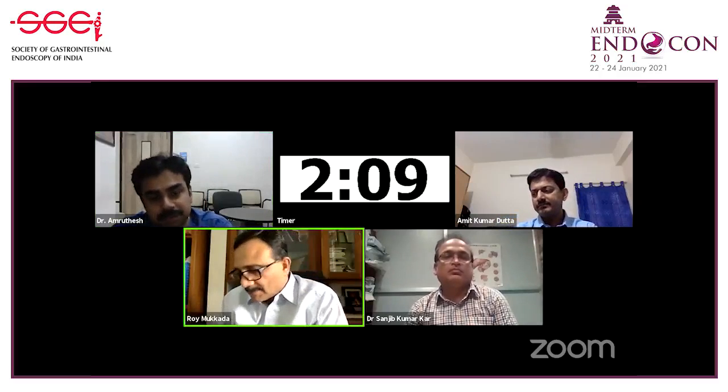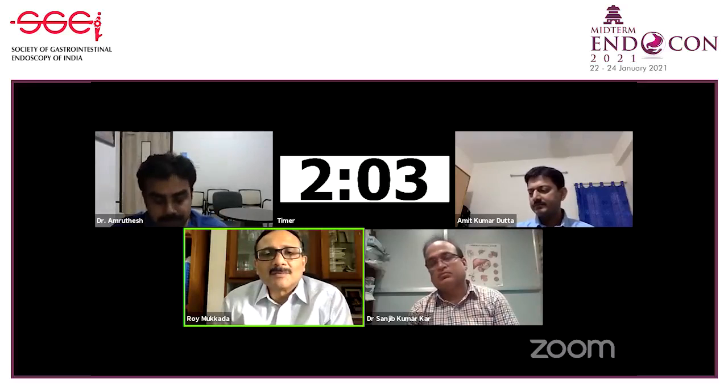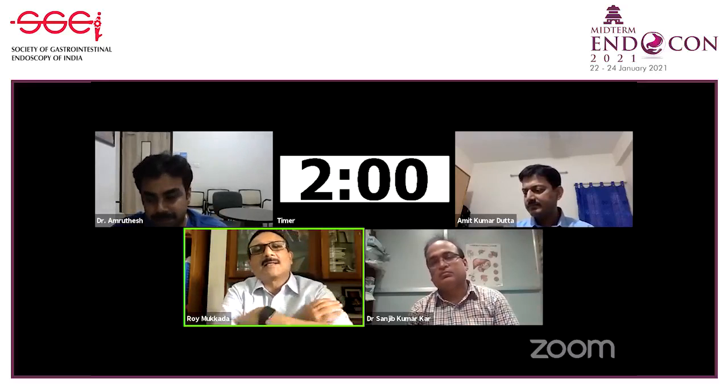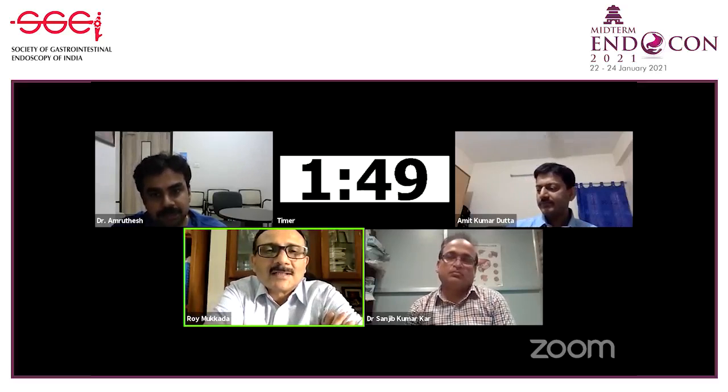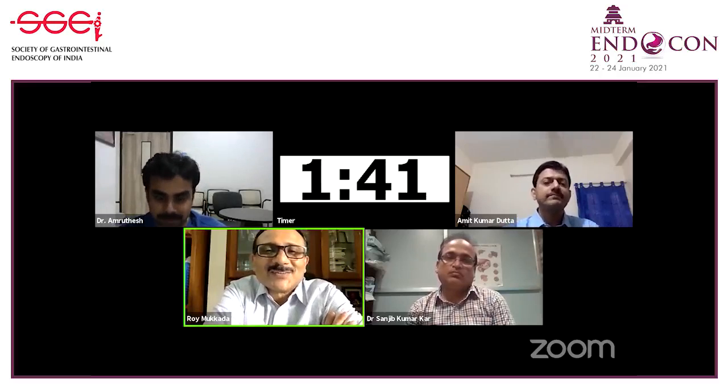Sir, in neuroendocrine tumors, will you do ESD in them generally, in the gastric as well as rectal? Neuroendocrine tumors. Again, it depends on your other imaging modalities. If you think that it can be done, it can be done. That's not a problem. But you have to have very proper other imaging modalities. Otherwise, you should not do it. Again the cost is a big thing. Even surgically, they can do a very good job.